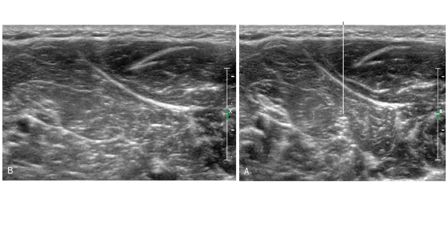For example, these are two ultrasound images of the same structure from the same place — an image of the median nerve in the forearm. The only difference is a slight change in the angle between the probe and the skin, which we can call slight tilting. This is an example of the anisotropy effect in action.